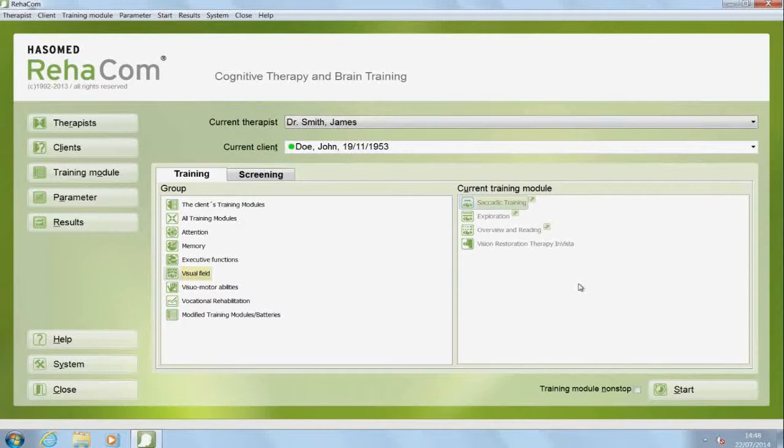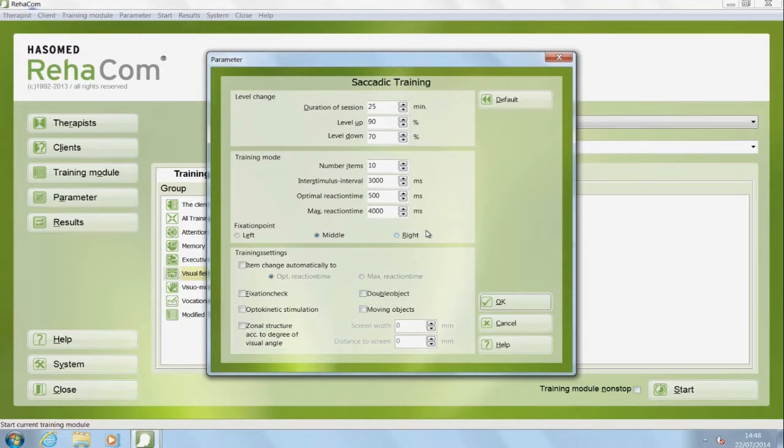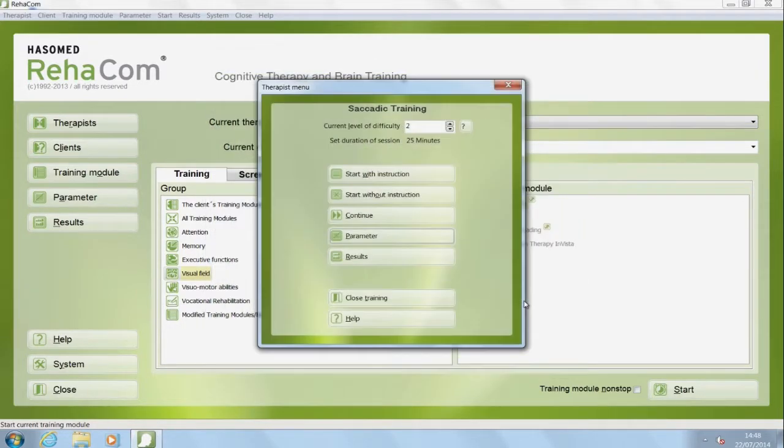Before starting the training module, it is possible to individualize the training parameters. Via the therapist menu, one can adjust the level of difficulty, duration of session, instructions and help or stressors according to the patient's needs. It is possible to change these parameters at any time during the training.